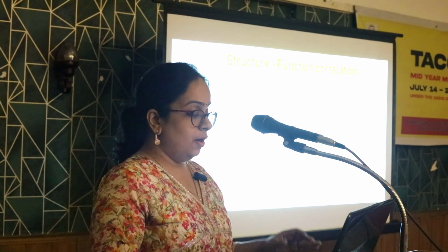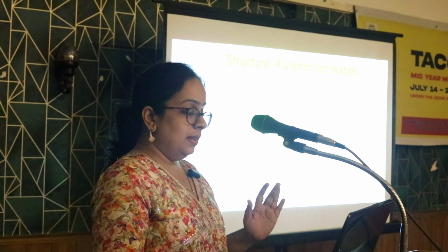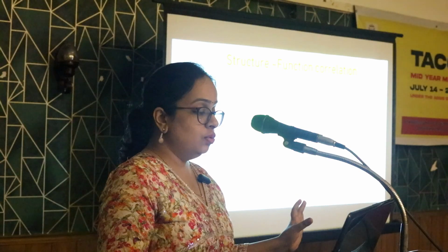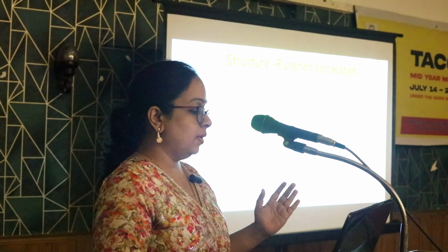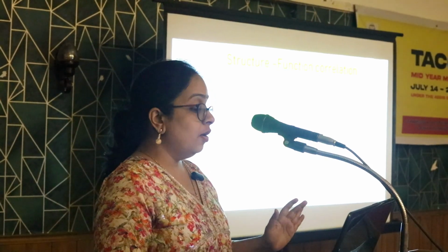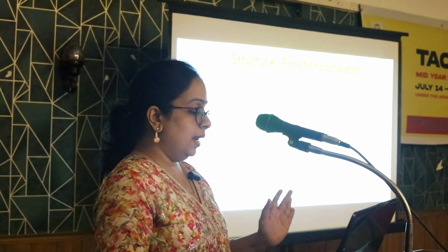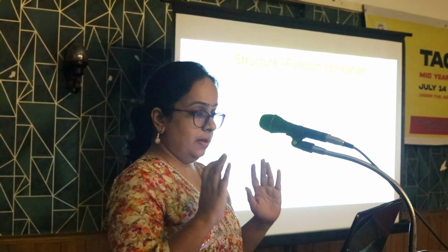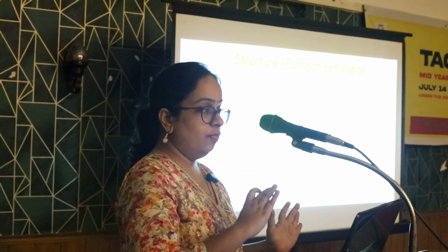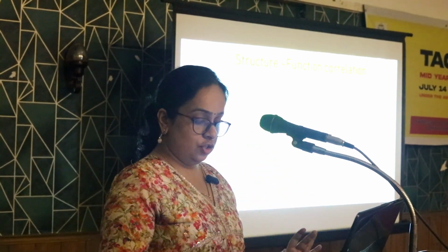Along with Hood et al., they have given a map where they combined the 24-2 with the RNFL. So if you see an RNFL defect or RNFL thinning at this point, where to look for the visual field defect? This is exactly the correlation of the RNFL with the visual field. So always when you analyze a patient, you should look for where the RNFL thinning is and where the visual field defect is.